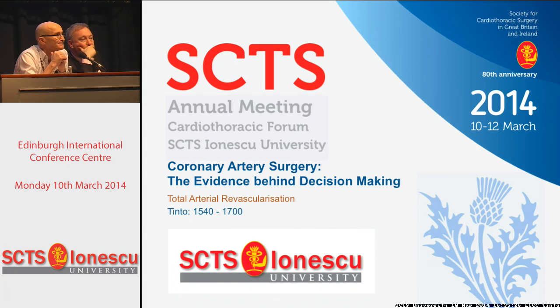I'm speaking about the distal end. Well, if you use a shunt, that's going to be less likely to happen. But it's well described. You can occlude either the toe or the heel, and you can still have flow through the bit you didn't occlude, and you'll think that graft is normal. You would not pick it up. Yeah. Thank you.